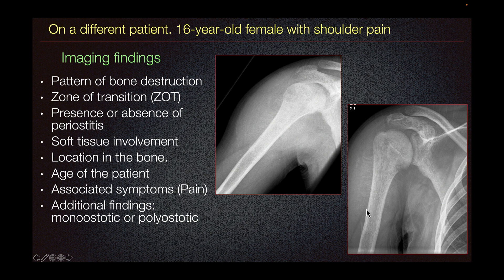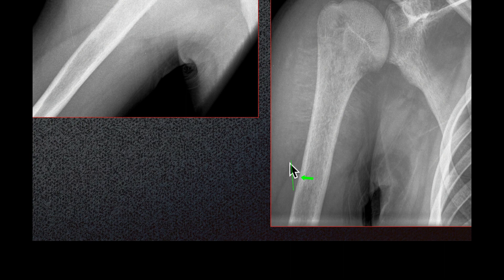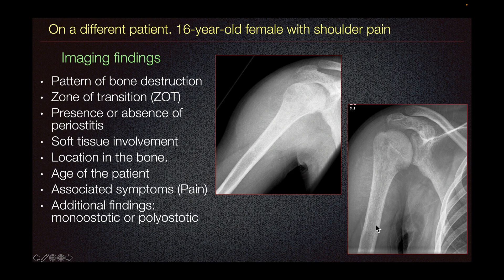The other thing that we look at is the presence or absence of periostitis. For this specific patient, we can see this linear density arising from the cortex — this is a sign of periosteal reaction, specifically the sunburst type of periosteal reaction. More distally, we can see this elevated periosteum, also a sign of periosteal reaction, known as Codman's triangle. Both are signs of an aggressive lesion, depicting aggressive overgrowth where the periosteum could not keep up.